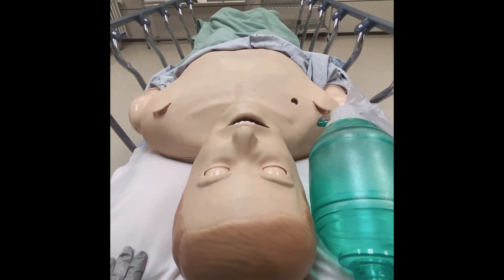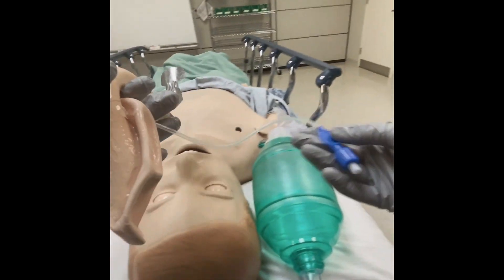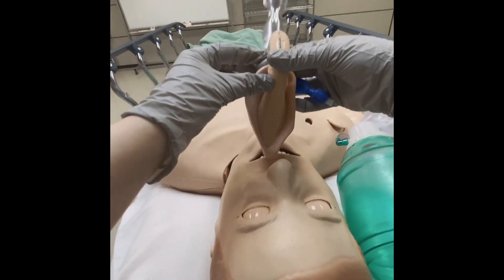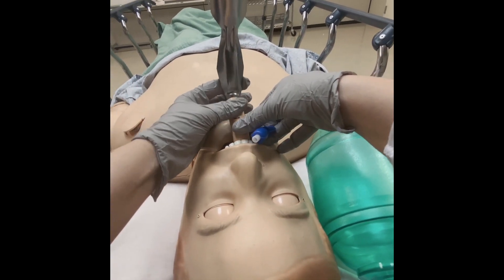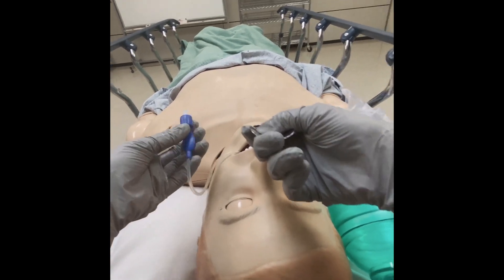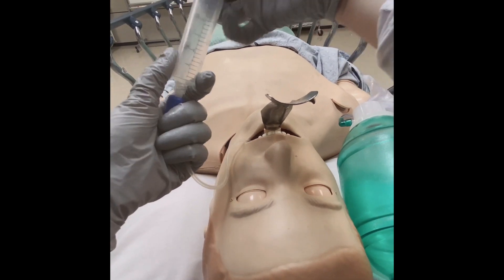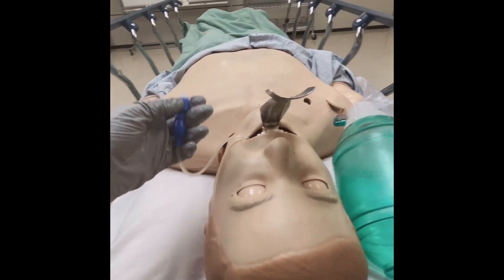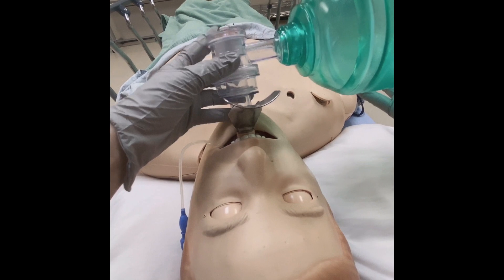Once you have given the medications and you're ready to intubate, start by grabbing the LMA tube. You want to ensure that the LMA cuff is deflated and that there is plenty of lubricating jelly on the LMA cuff. Insert the LMA by guiding the cuff along the hard and soft palates and directing posteriorly. You can adjust the position of the LMA using the handle. Once the LMA is in, inflate the cuff using your 20cc syringe. Confirm LMA placement with BVM and look for chest rise.